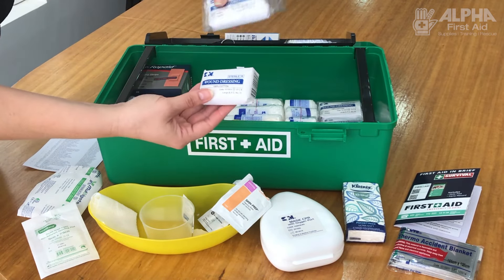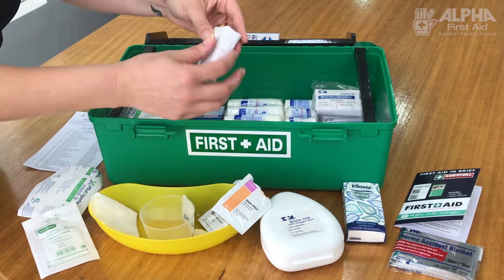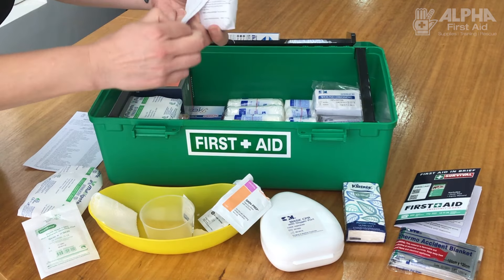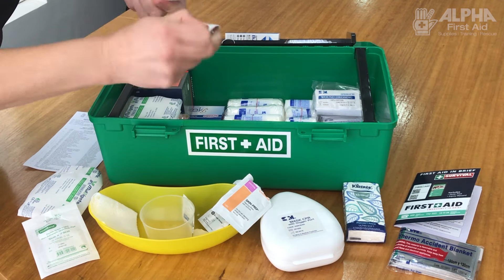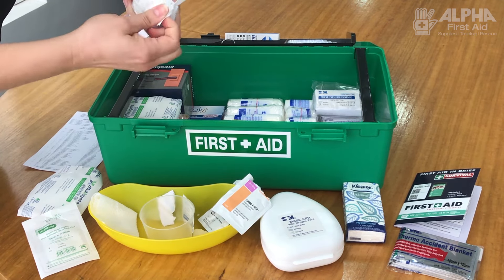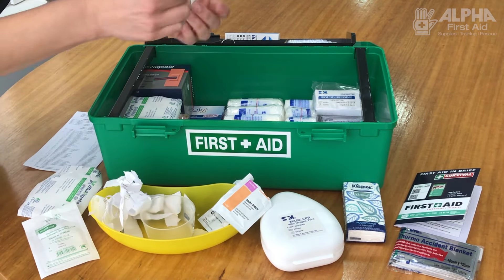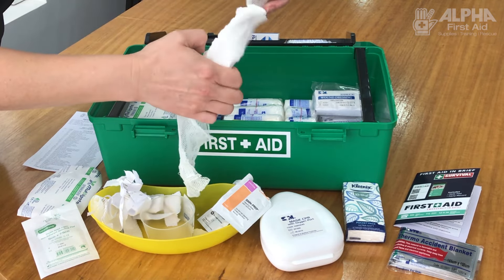A lot of kits have wound dressings in them and people aren't sure exactly what they're used for. Very much like the old field dressings, they're very handy if something serious happens. It has its own padding and its own bandage attached. They are really handy dressings, but they tend to sit in kits because people are unaware of how to use them.